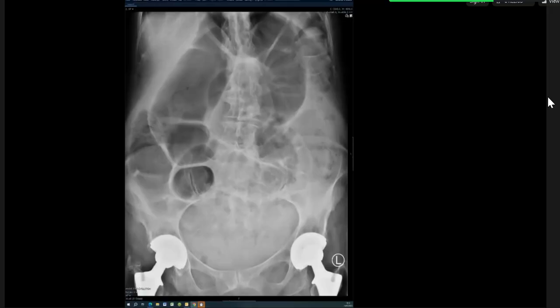So the patient does not have ulcerative colitis, and is not on steroids. He's not immunocompromised. The patient has abdominal pain for 4 to 5 hours. You said you wanted to do a CT? Yes, contrast enhanced CT. To look for? To assess the cause of the intestinal obstruction.